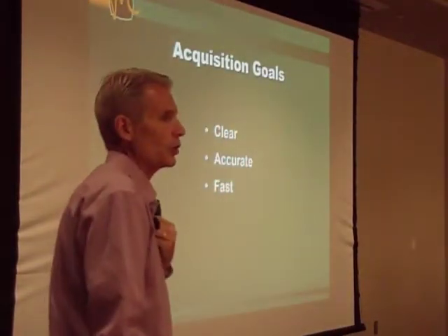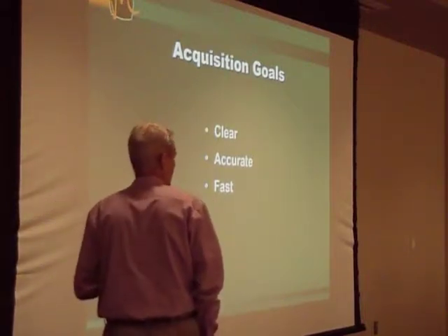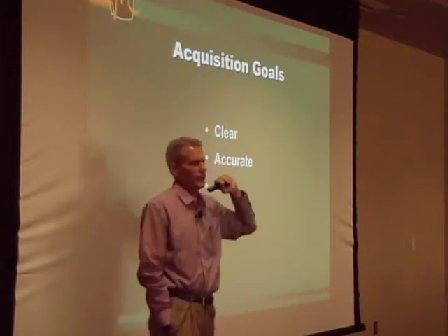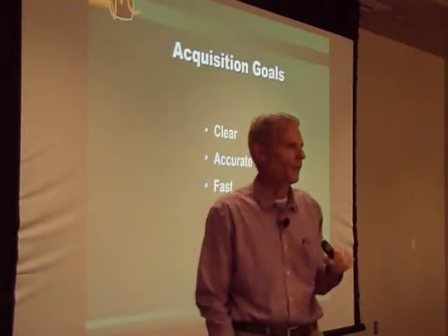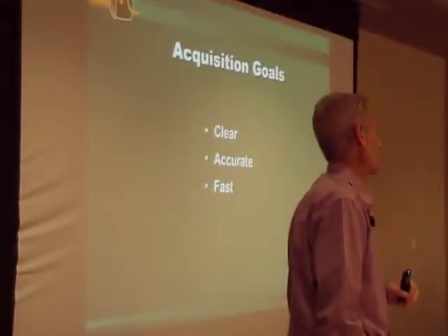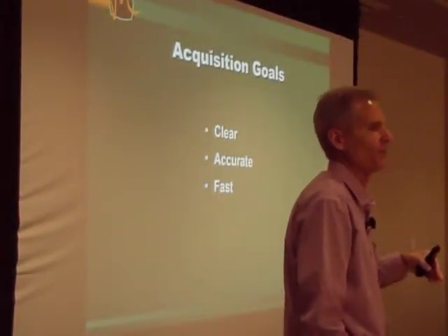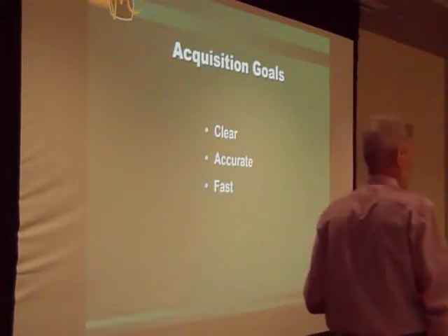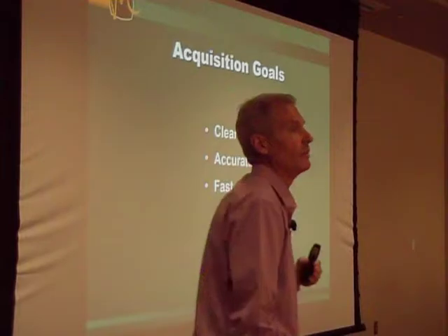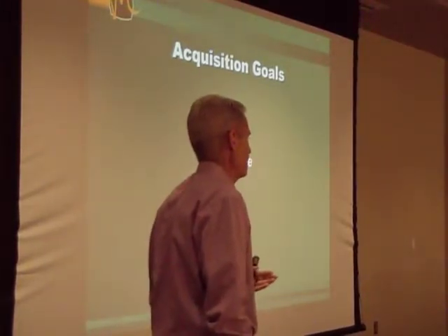So our acquisition goals, I would think you would all agree with me that we want to make sure that we're trying to get a clear, very accurate tracing, and let's face it, we want to do it as quickly as possible. We know that's not always possible. Think about your winter months, where patients have layers and layers of clothing on, or let's talk about the female patients, who now we have to worry about maybe a bra that's on. And it's very difficult sometimes to get to your patient's chest.